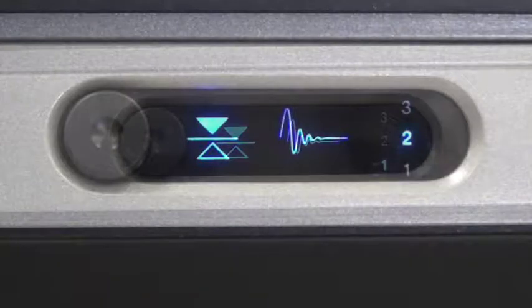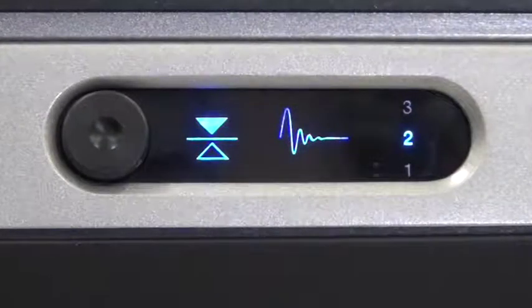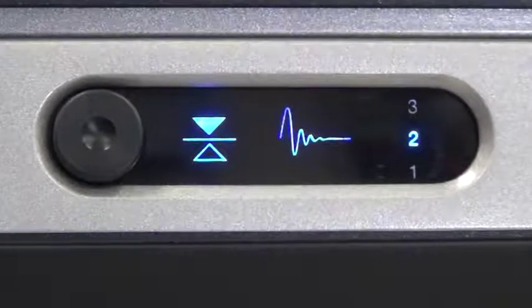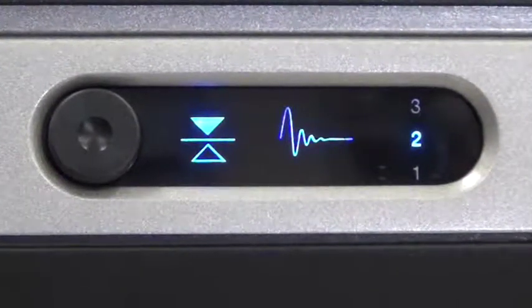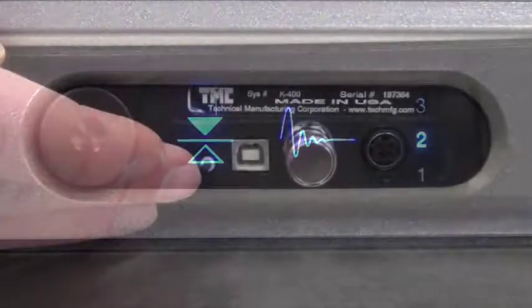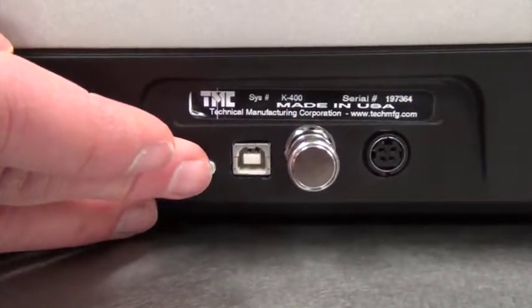The K400 will select one of three active gain settings which is most appropriate for the environment. The system is ready for use when both indicators and a gain-match setting are solid. This feature is also user-selectable.